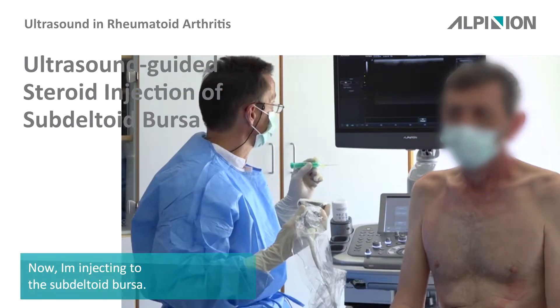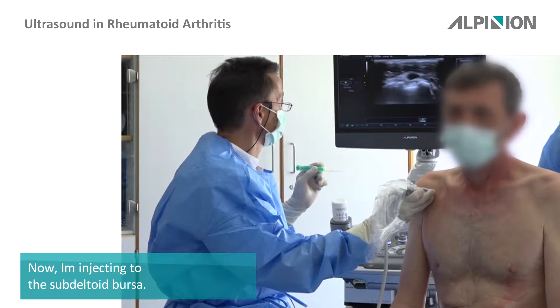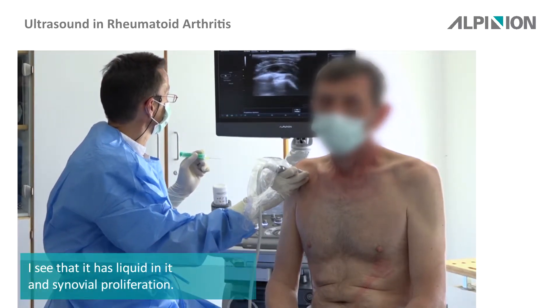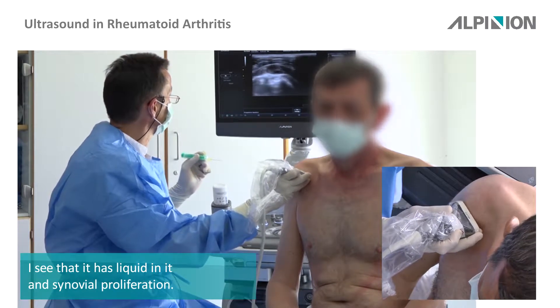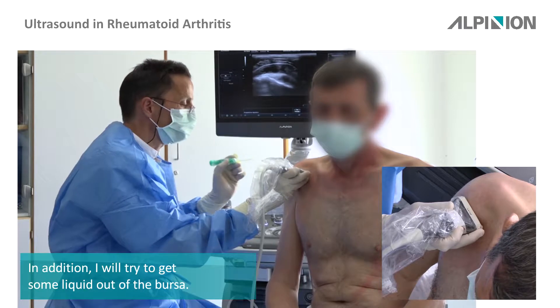So now I'm injecting the bursa, the subdeltoid bursa. I just look at the subdeltoid bursa — here you see the subdeltoid bursa with liquid in it and with synovial proliferation. Now I try to get some liquid out of the bursa.